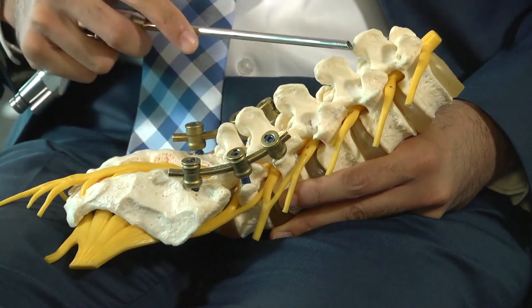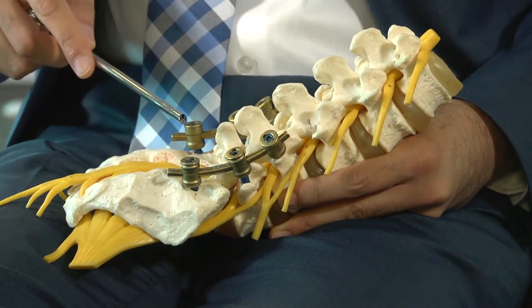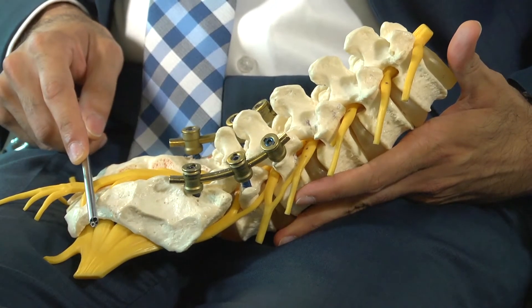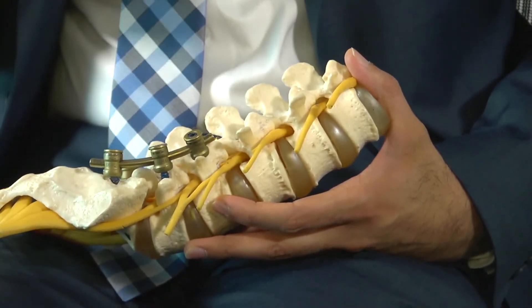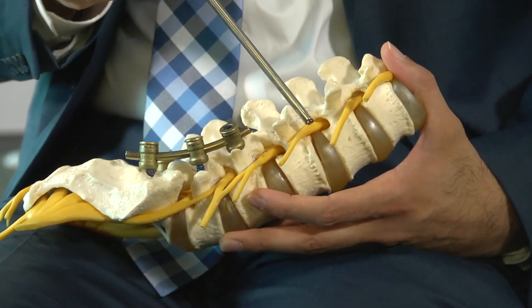To demonstrate endoscopic spine surgery, I'm going to show this on this model right here. On this model, we have a portion of what we call the lumbar spine, which is the lowest part of our spine. In endoscopic surgery, what we're essentially doing is putting a camera in the spine to treat a problem where there's compression on the nerve.